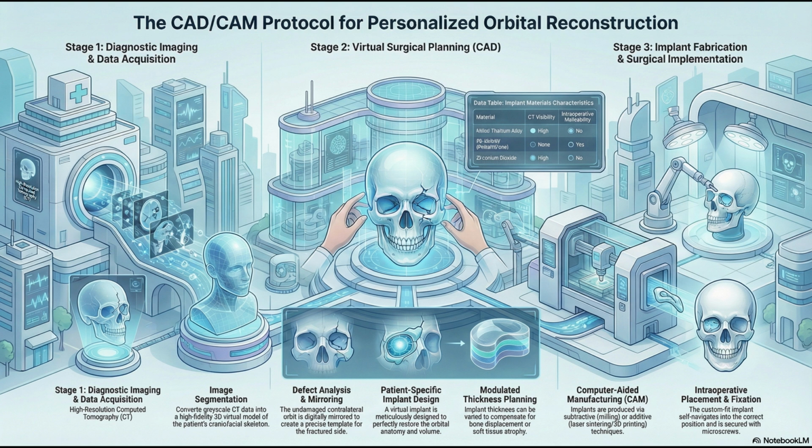So we're at the end of our discussion, and my position really hasn't changed. I still believe that the initial data acquisition and segmentation is the single point of highest vulnerability. The success of the entire CAD-CAM reconstruction is fundamentally capped by the quality of that initial volumetric data. Without a flawless digital foundation, the most sophisticated design work, the most advanced materials, they just can't compensate for a model that doesn't accurately represent the patient's anatomy.